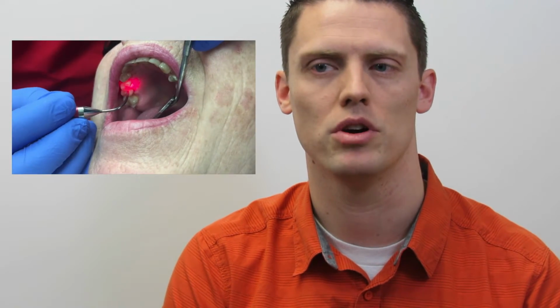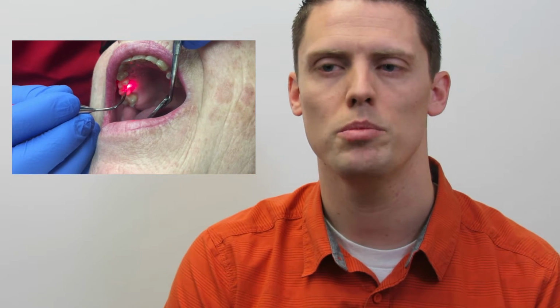There are straightforward steps in the LANAP process. I'll go over those just briefly. After numbing the patient, we go through with the laser and actually just pass the laser fiber underneath the tissue a couple millimeters. What this does is it opens up the tissue and also starts the process of sterilizing and removing the bacteria and the viruses from the pocket.